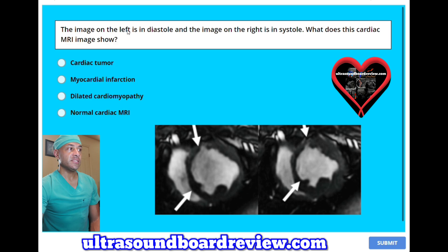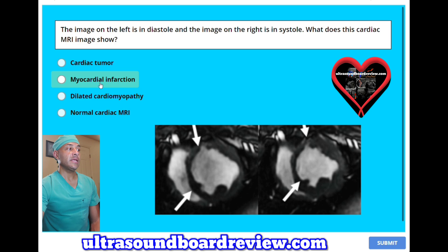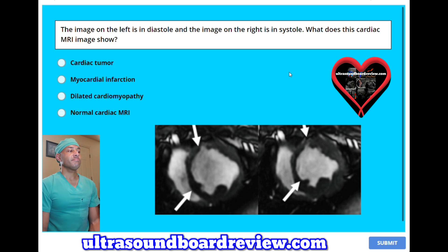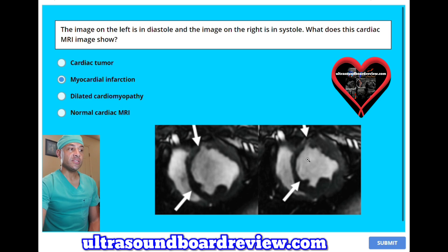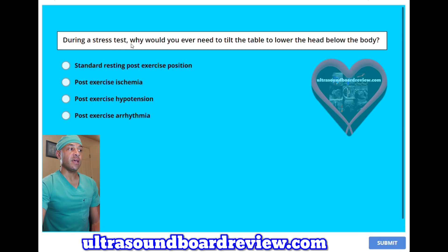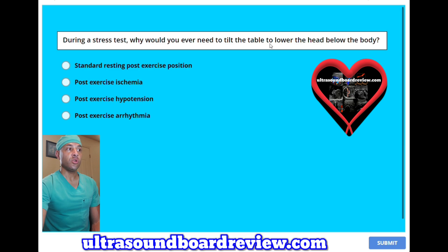The image on the left is in diastole and the image on the right is in systole. What does the cardiac MRI image show? A, cardiac tumor. B, myocardial infarction. C, dilated cardiomyopathy. Or D, normal cardiac MRI. The answer is B, myocardial infarction.